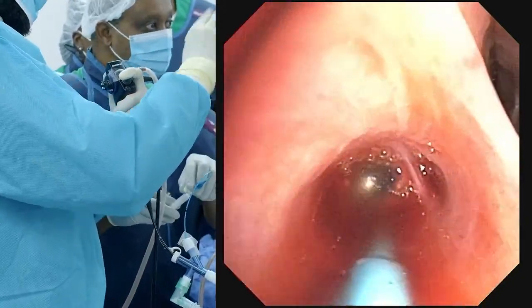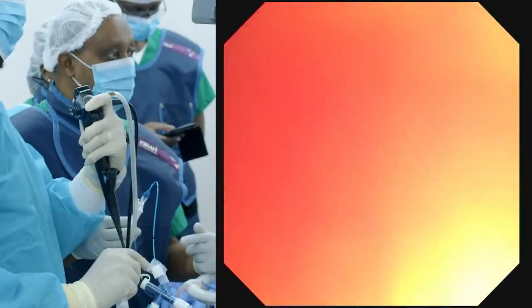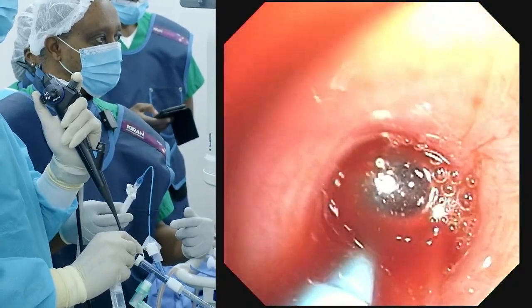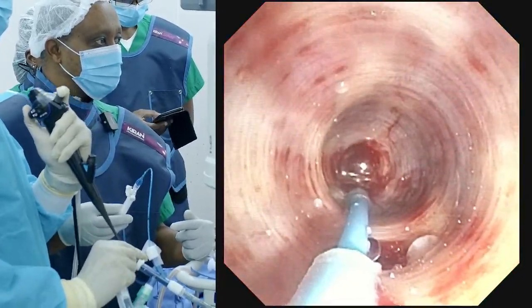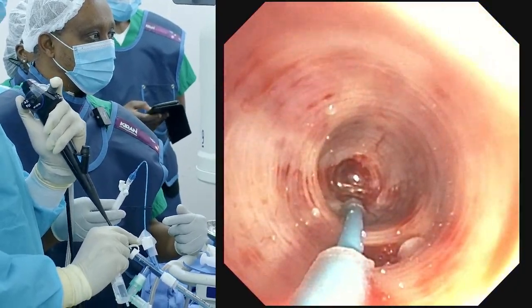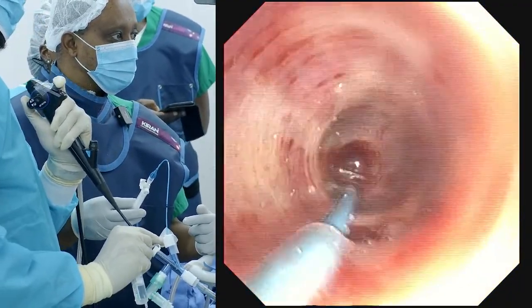The blocker is just to stop it now. So we wait maybe 30 seconds or so, wait for it to cool off, then we recheck. I'm actually against the balloon wall. You see where the tip is sitting. Actually, yeah.